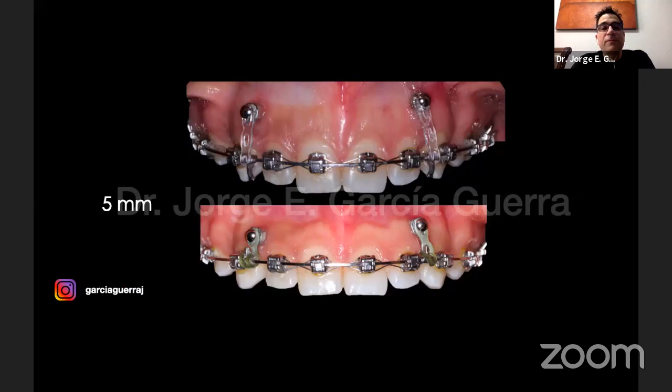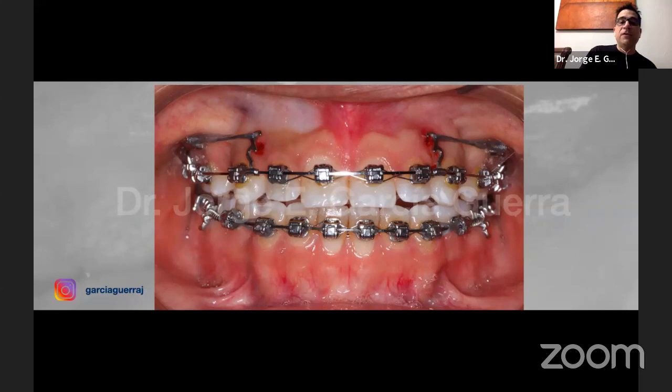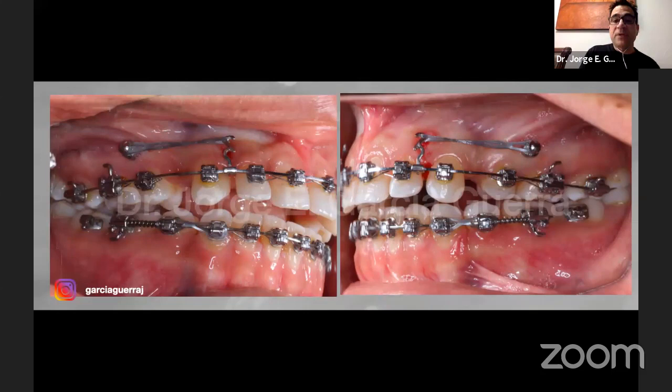Now you can see how the crown size is shorter because of the gingival tissue. At the moment that we start intruding the teeth, we're also going to have an overlap of the gingival tissue. So we're going to need to do some gingivectomy at the end. But this helps us a lot to correct the intrusion on the anterior parts for the gummy smile. Now, in this case, we changed the mini implants. We took them off. We sterilized them, and we put them in between the roots of the first molars and the second bicuspid. So this helps us to close the spaces. You can see here how big an open bite we have.